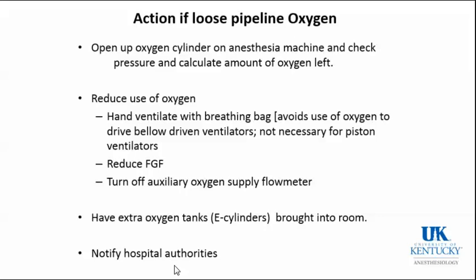Yes? So if there's a pipeline failure, is it likely that it would happen to all our ORs? Well, not necessarily. I mean, it could, but you could have a selective problem like a piece of line or something that was in your particular room.